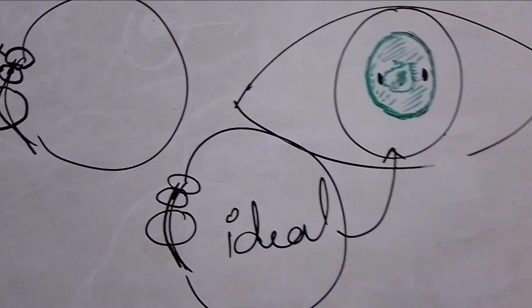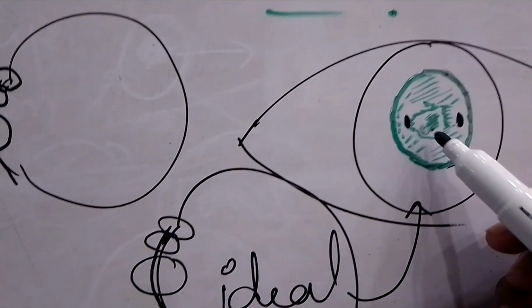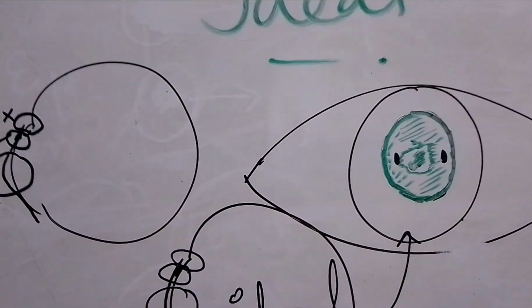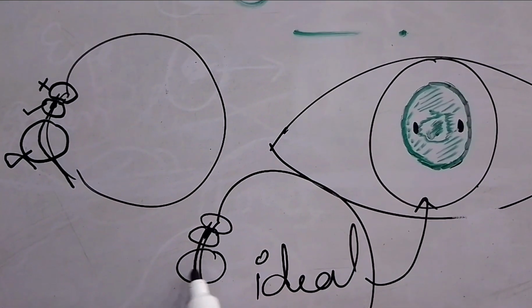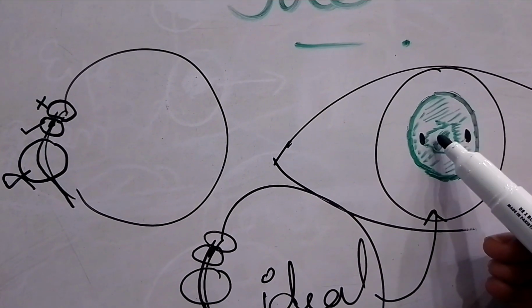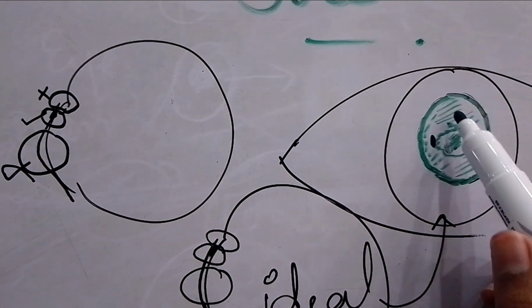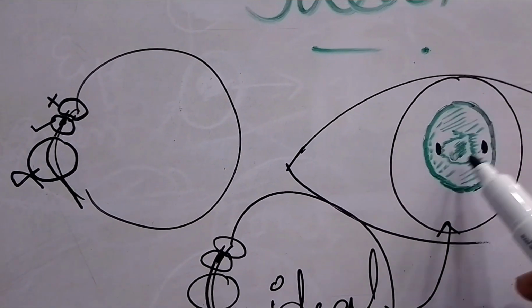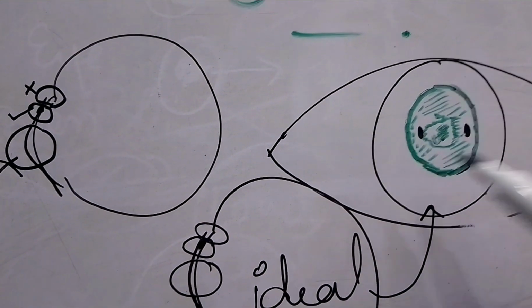and the fluorescein pattern that you will see will be little pooling that is more vibrant in the center, right? Because the contact lens and cornea are not in touch, you will see a little amount of pooling that is equal all over the contact lens, not even more and not even less.